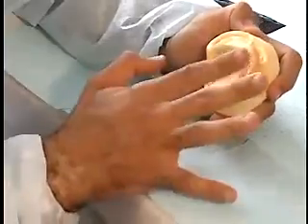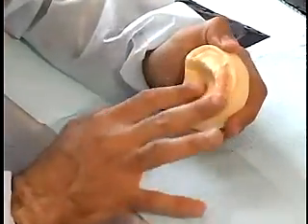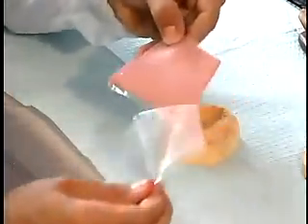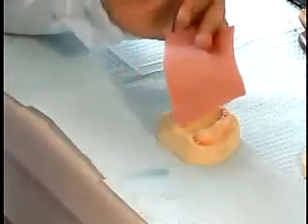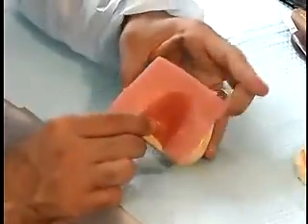Lubricate the ridge and land areas with Vaseline. Remove any gross excess. Adapt a sheet of pink triad base plate material to the maxillary cast starting in the palate and proceed to the borders to prevent trapping air in the palate.